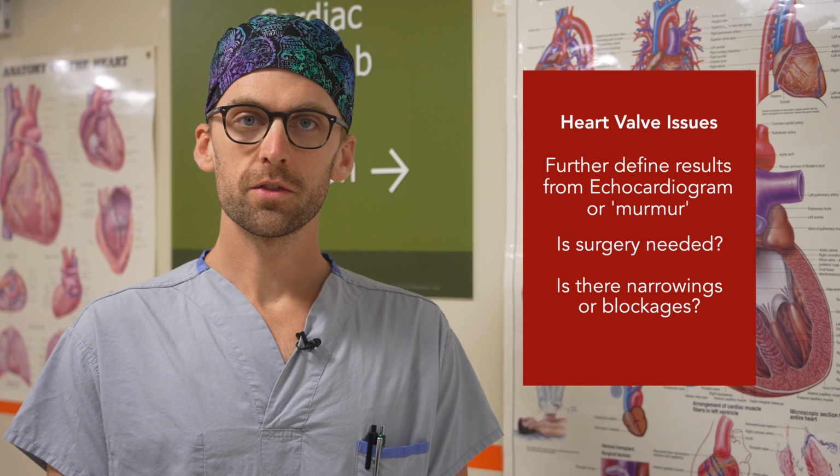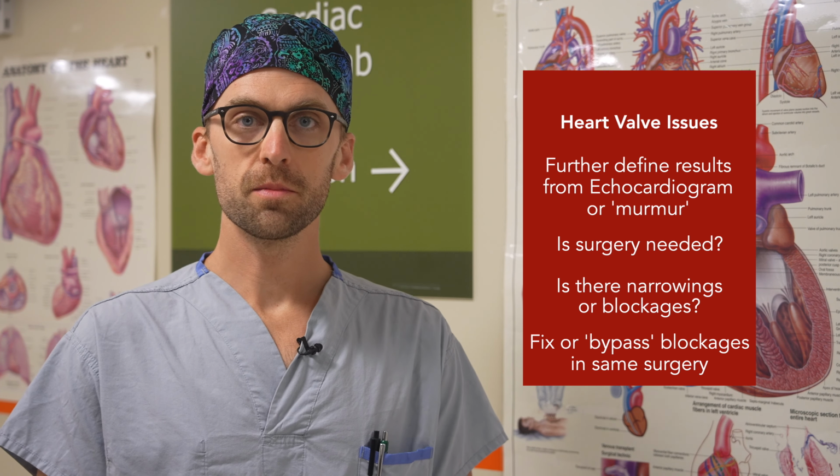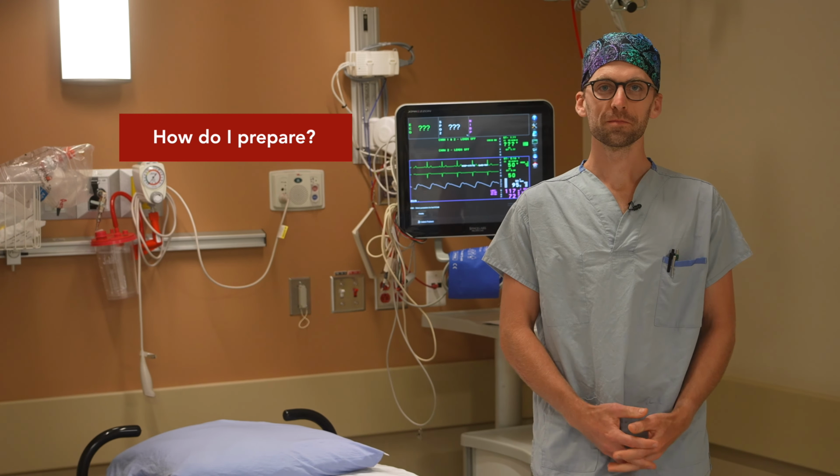An angiogram provides more information to the healthcare team and helps determine if you need surgery to correct your heart valve issues. It also determines if you have narrowings or blockages in the heart arteries. If you do, the surgical team may plan to fix or bypass the blockages at the same time as your heart valve surgery.